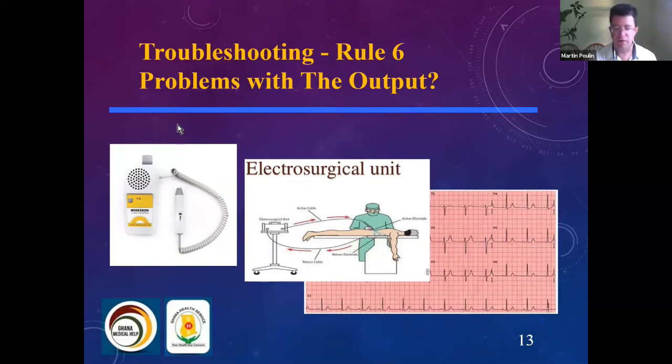The most common devices with output graph recorders, such as electrocardiograms or electroencephalography. The problems with those graphs often are that the paper is not installed correctly, or the paper is not moving at a constant speed. Other problems involve dirt or wax buildup on the print head or stylus.